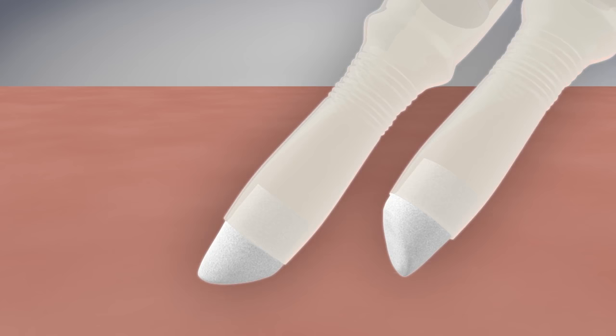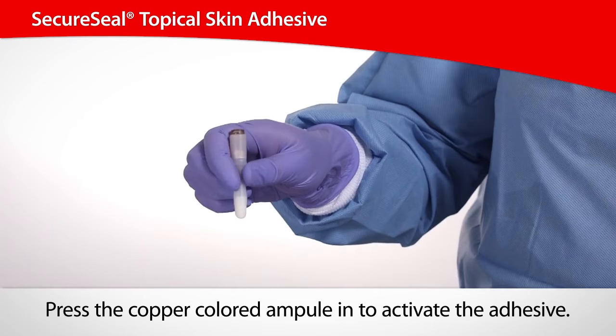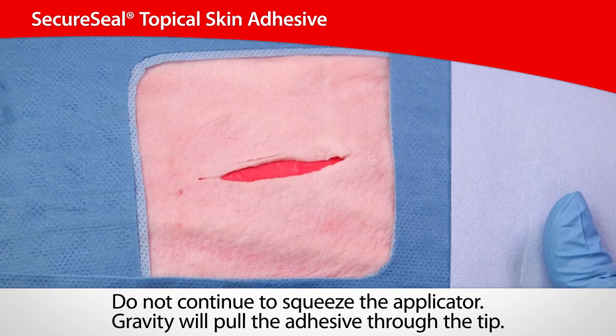SecureSeal features a patented glass-free applicator with a dome tip that enables wide or precise coverage. Press the copper-colored ampule in to activate the adhesive. When the adhesive enters the sleeve, squeeze the ridged portion of the applicator gently to prime the tip.